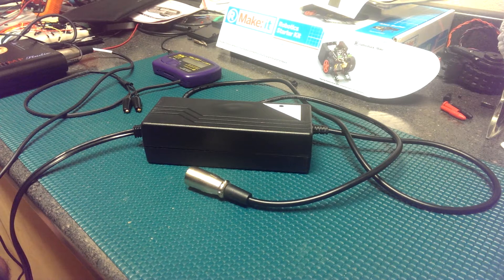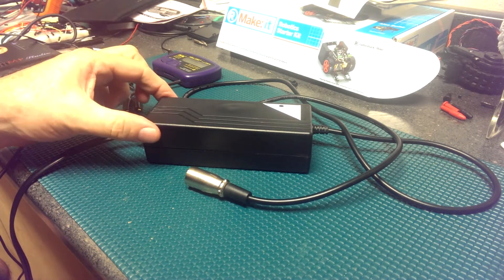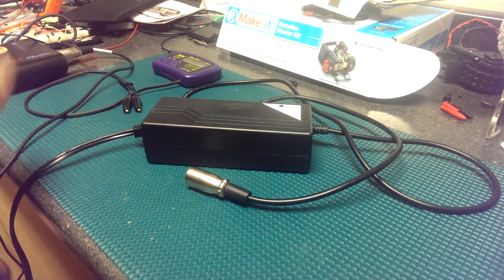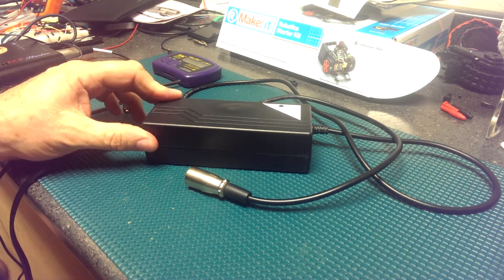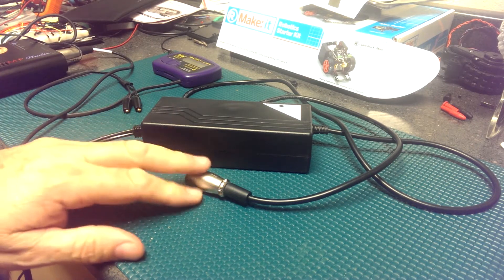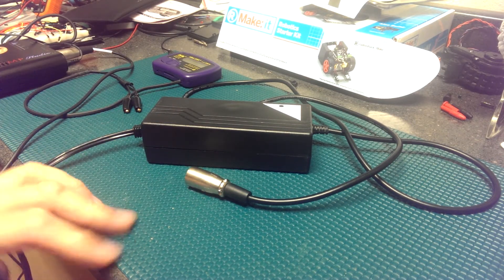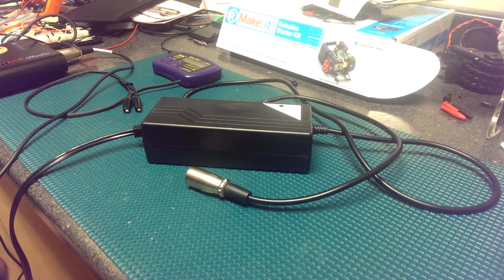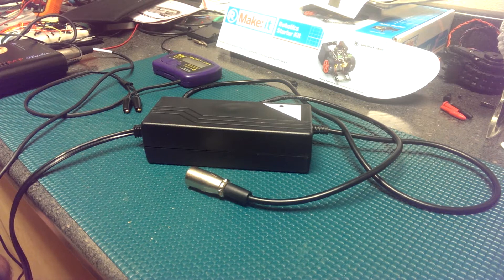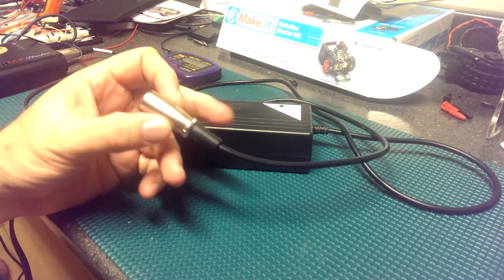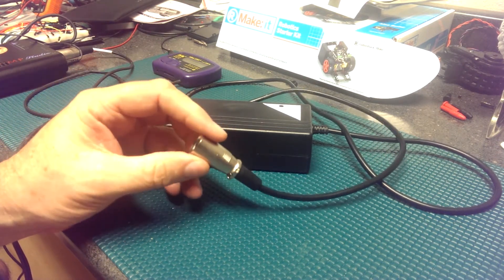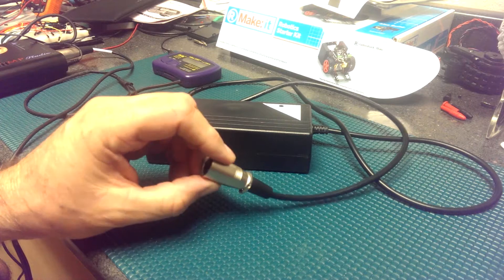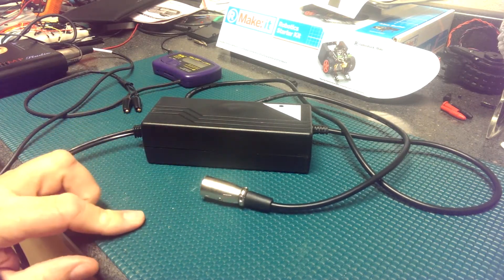I plugged it in. There's a fan here on the back of the unit. The fan doesn't turn and it doesn't charge the batteries in the wheelchair. So first thought I was going to plug it in and put a meter across the leads on the XLR connector.